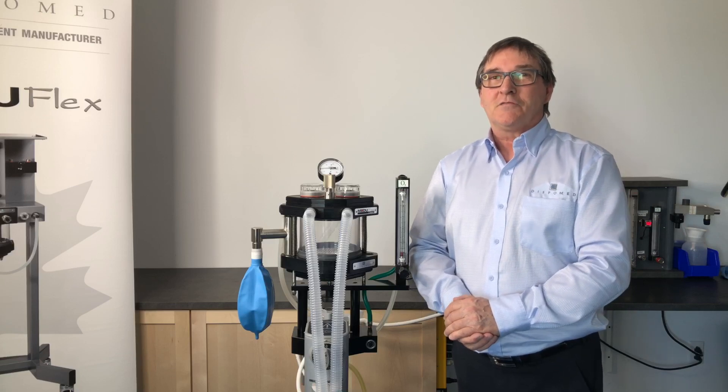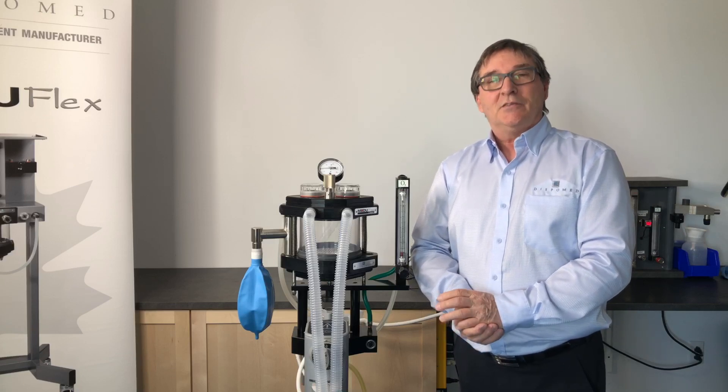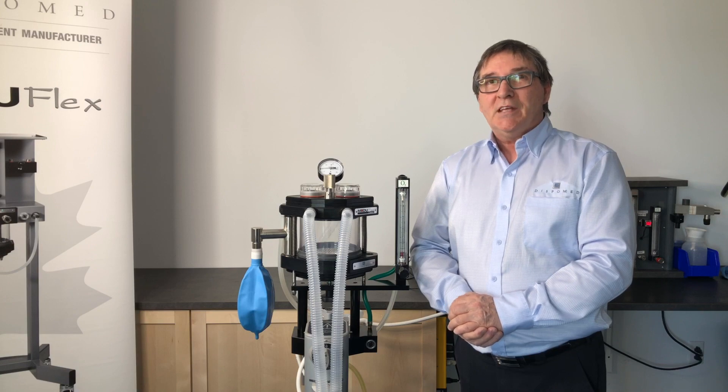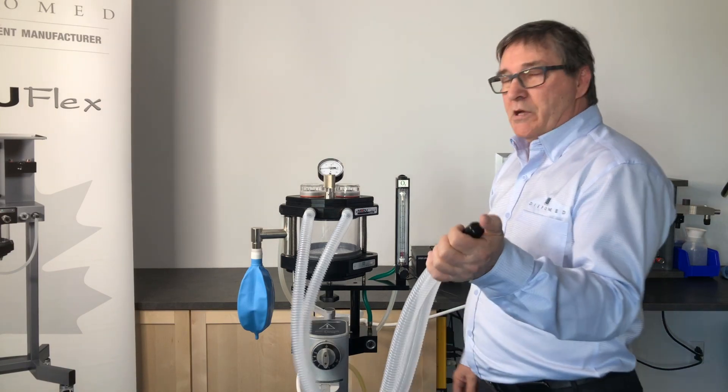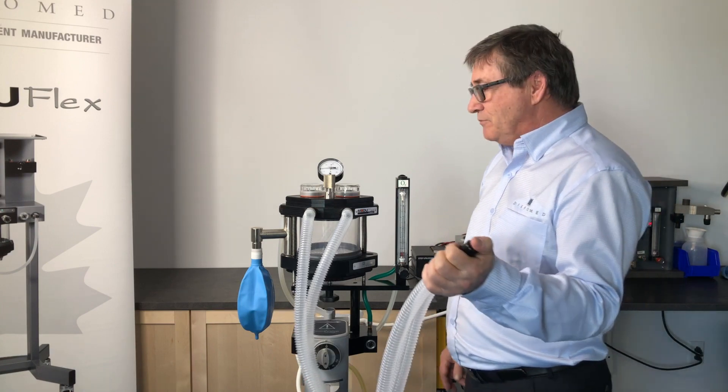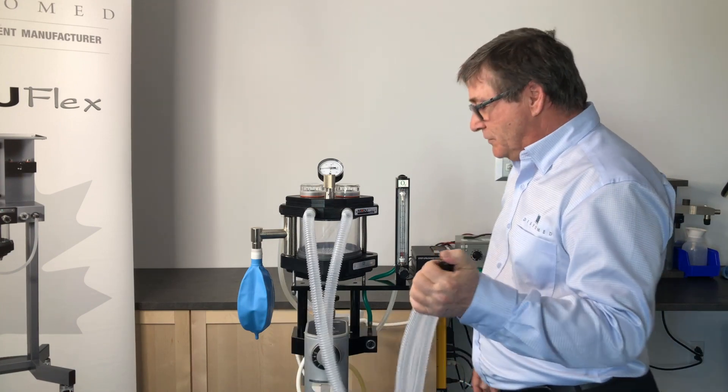Welcome to another video from Displomed. Today, the subject is: are your leak tests sufficient? When we perform our leak tests, we obstruct our patient circuit with our thumb, or a plug if we have one.